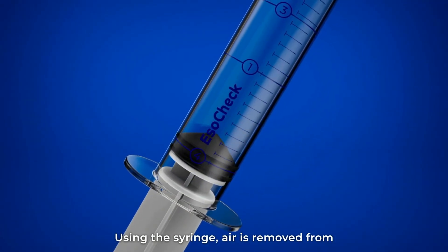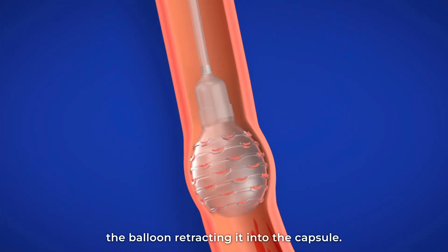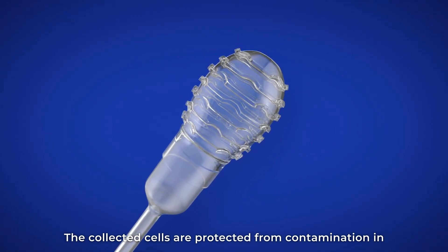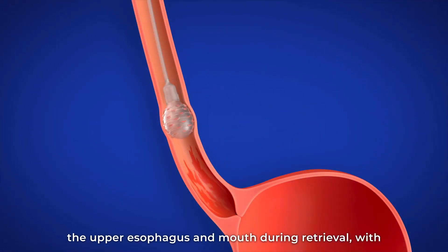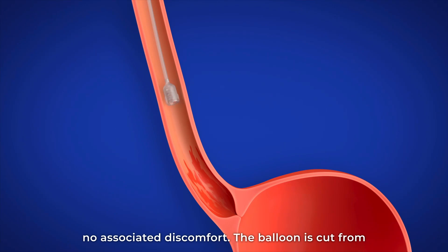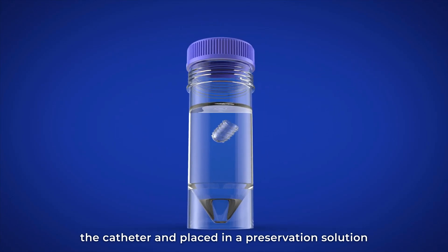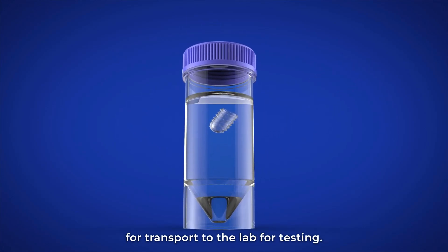Using the syringe, air is removed from the balloon, retracting it into the capsule. The collected cells are protected from contamination in the upper esophagus and mouth during retrieval, with no associated discomfort. The balloon is cut from the catheter and placed in a preservation solution for transport to the lab for testing.